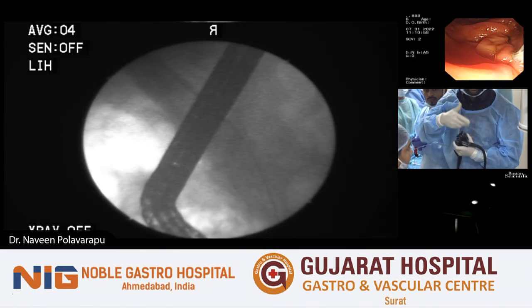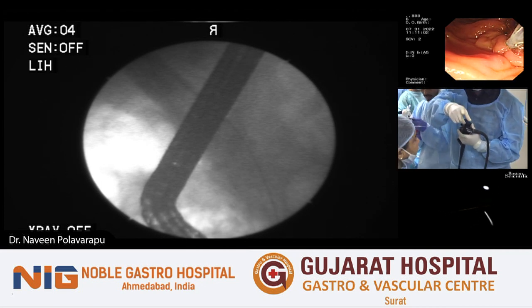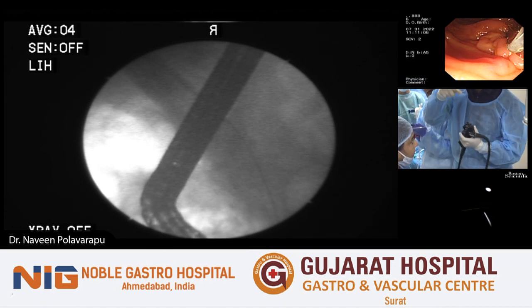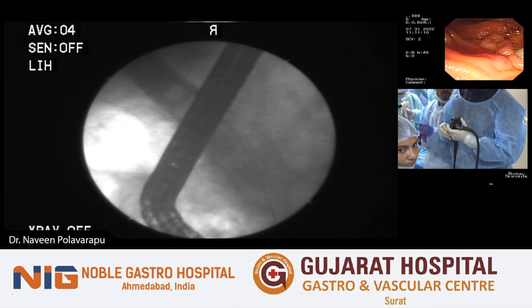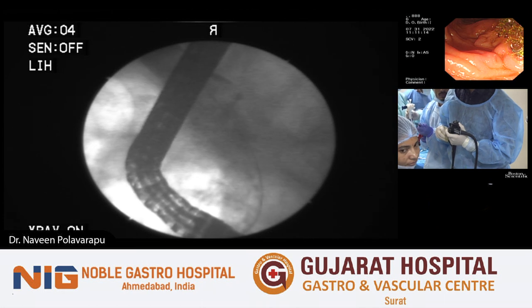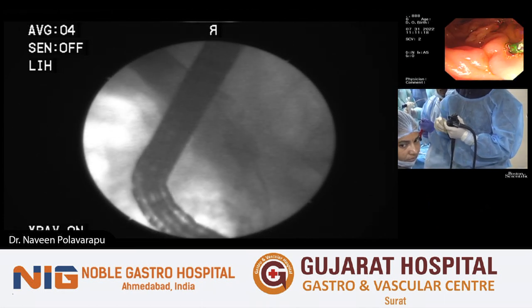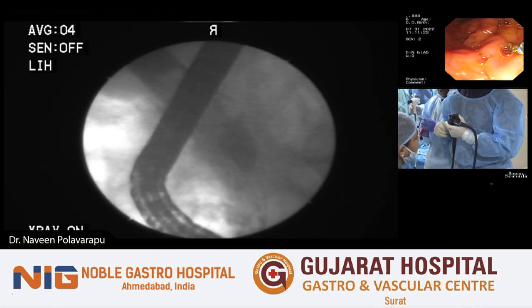So this is very important. In spy, you cannot put too much contrast. In fact, this is the live picture, right? In spy, we do it once, screen, I should know the size of the duct. So we already know what the bile duct diameter is because of the previous procedure. Even if you are doing it at primary, don't put too much contrast, even less than what is being put. Contrast is not good in spy. You can't see things properly.